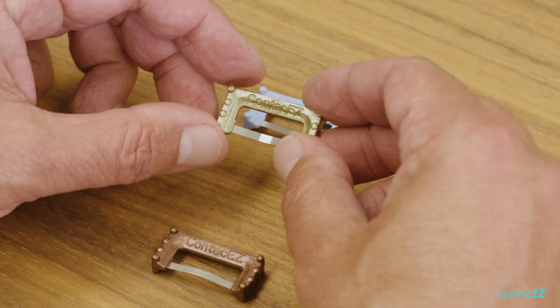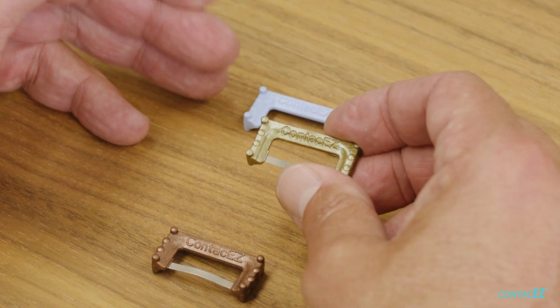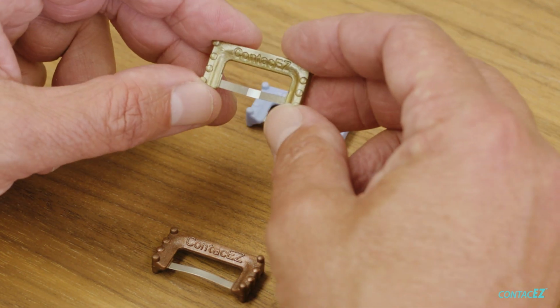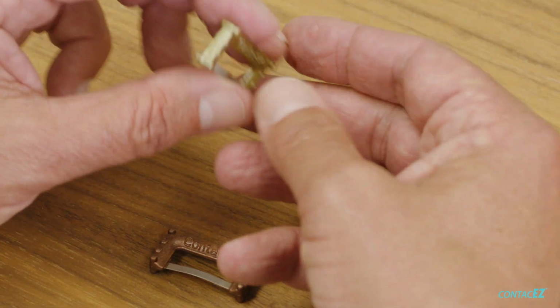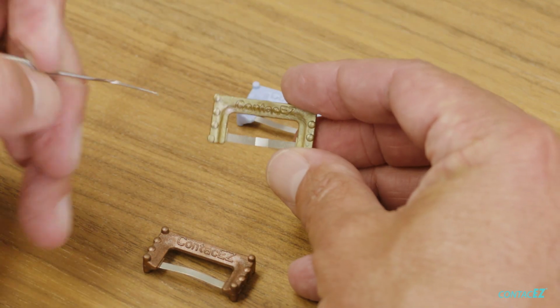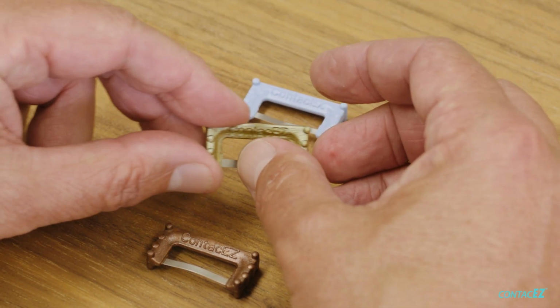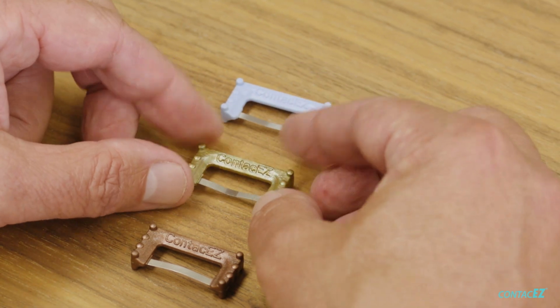The trimmer is this gold narrow strip, and this is non-serrated. So this assumes that we don't have the large overhang, or if we did, we already cut it off with this. And now we're going in just to do some reshaping. One of the interesting things about the gold strip, it's single-sided, again with a coarse to medium diamond, but it's got this central gateway where it doesn't have any abrasive material. That just allows you to slip through the contact a little easier and then use the sides of it once you get subgingival down on whatever material you're trying to reshape.